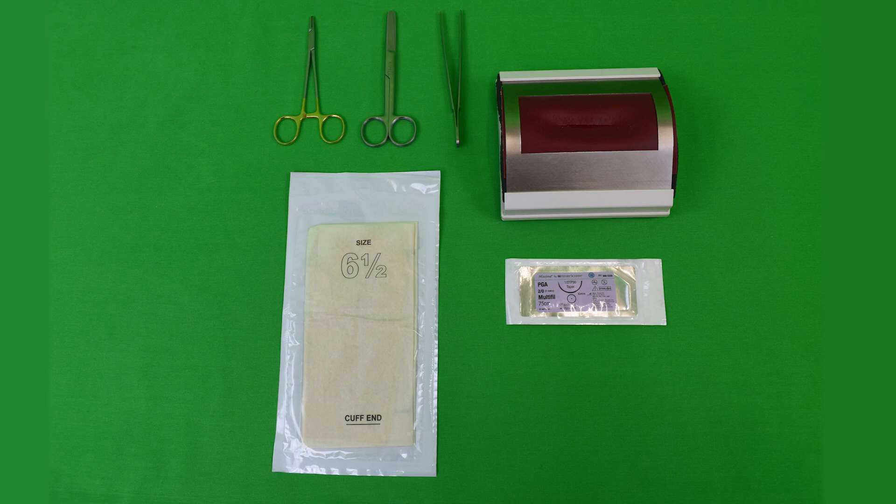Needed for this skills lab exercise are a needle holder, a pair of surgical scissors, anatomical forceps, the suture pad, as well as gloves and a needle and thread combination.